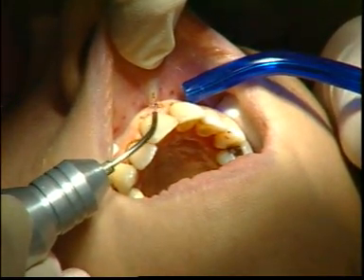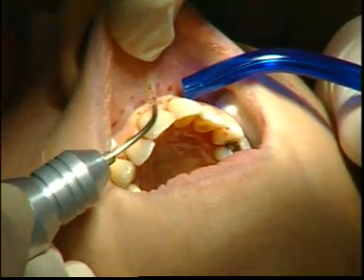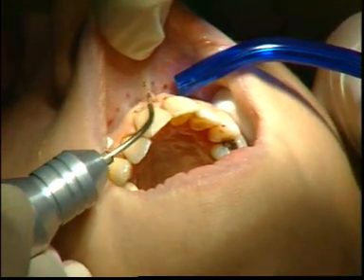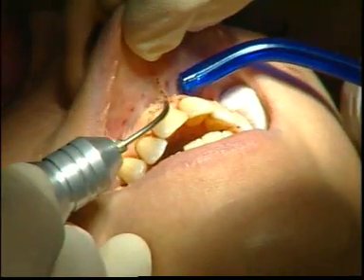Dissection takes place in layers with the fibre parallel to the maxillary alveolar process. Instead of the medieval use of scalpels, we are here using the Aura laser jet to perform clearly visible and completely bloodless mucogingiVal surgery.